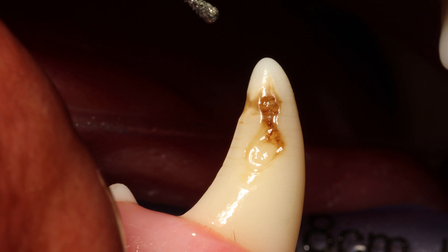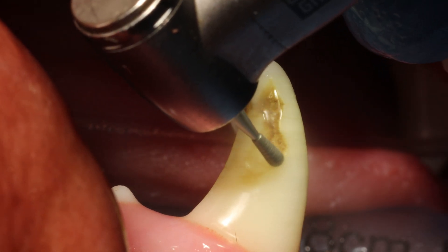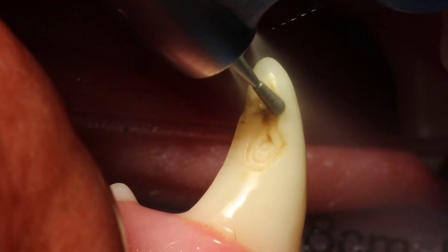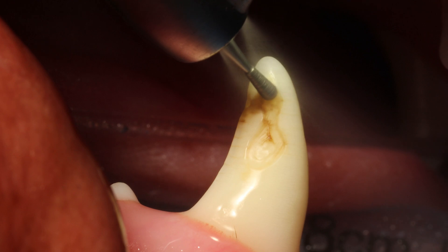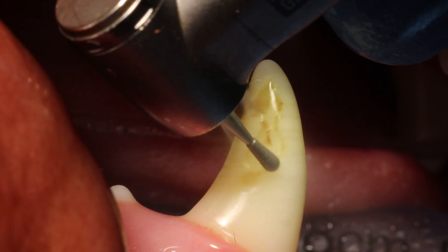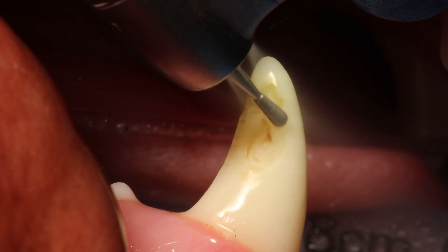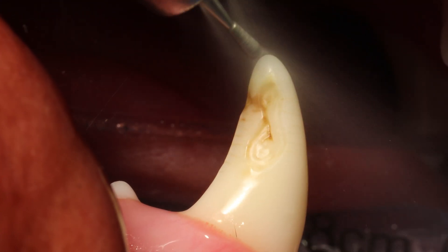So the way we do it is we use a diamond burr — this is a pear shaped diamond burr — just to get rid of that diseased enamel and dentine. You want to use controlled movements; don't take too much, and get rid of all that diseased dentine and enamel.